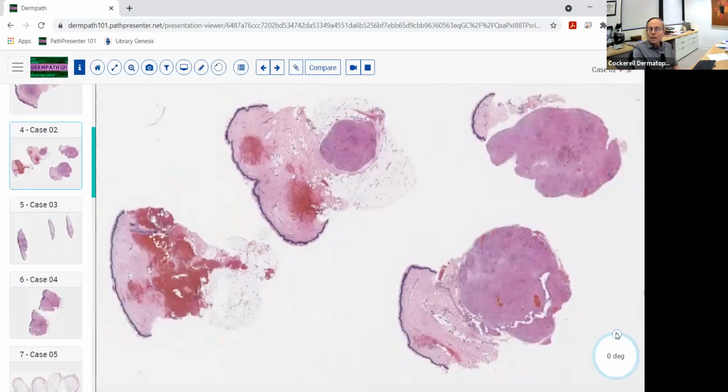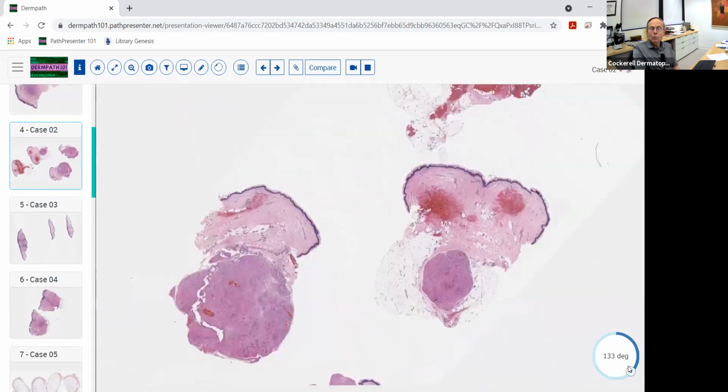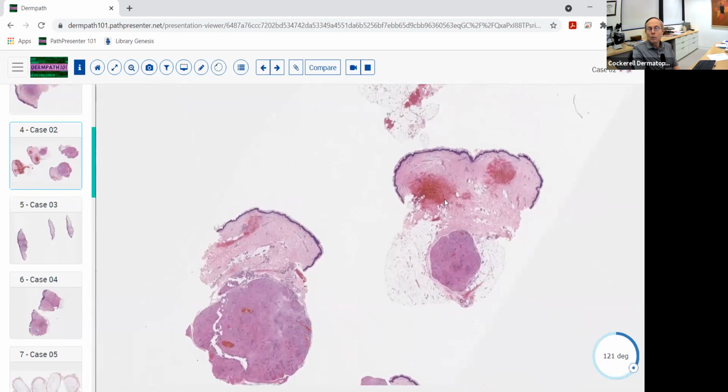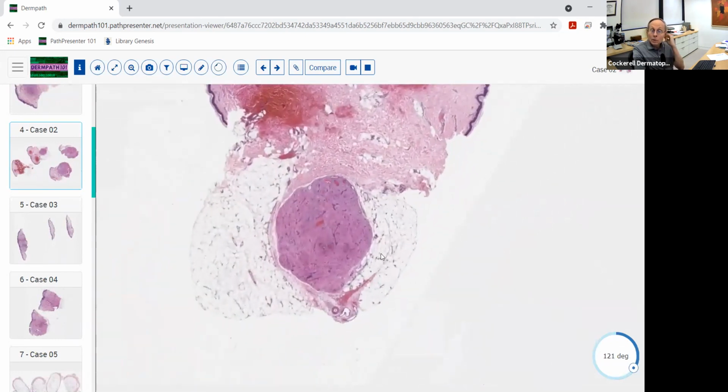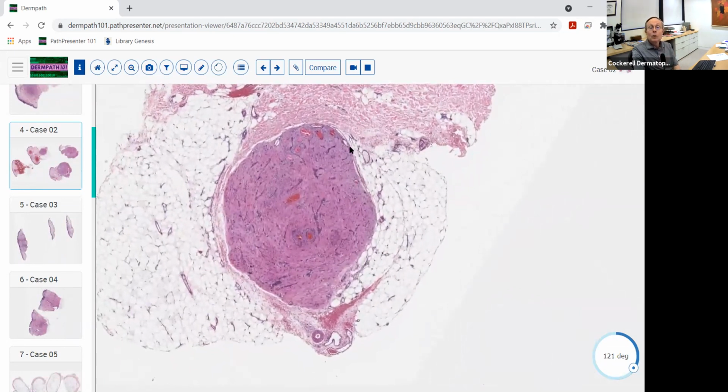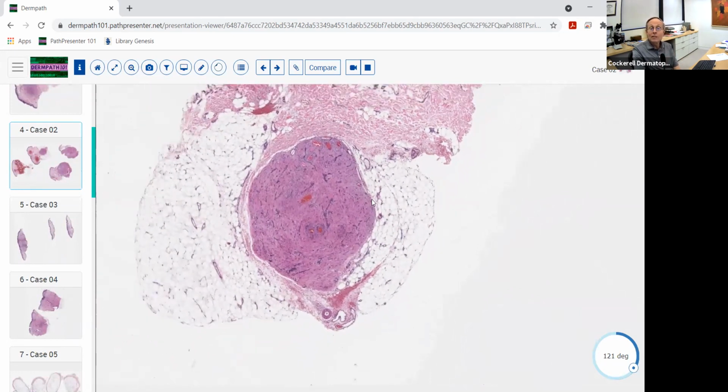Now this, in contrast to a pilar or an erectile leiomyoma, is an angioleiomyoma. I'm going to show this central one, even though there's a large one off to the side, because it shows a nice example. Notice it's actually really and truly, in this case, subcutaneous.